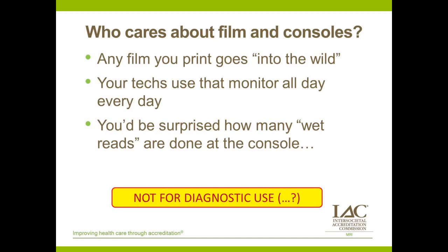But if you're printing film, just remember your film goes into the wild. And even if you didn't print it for someone to interpret diagnostically at your facility, once you send it out the door, someone else could well use it that way. So you're responsible for the quality that you produce. So you want to make sure that your filming devices are going to meet a diagnostic standard, even if you're not using them that way. Right? So that's something to consider when you're deciding whether you're going to have hard copy at all.